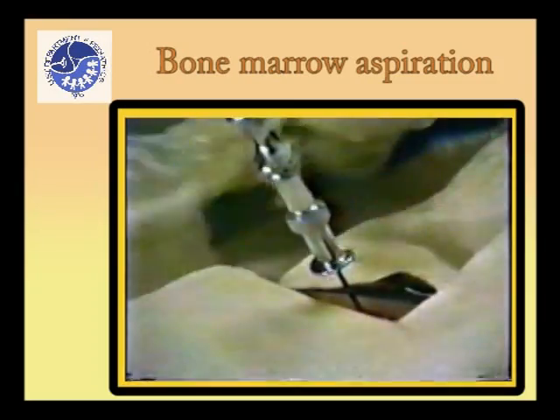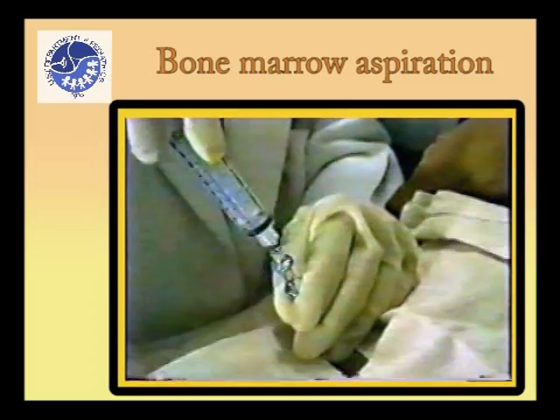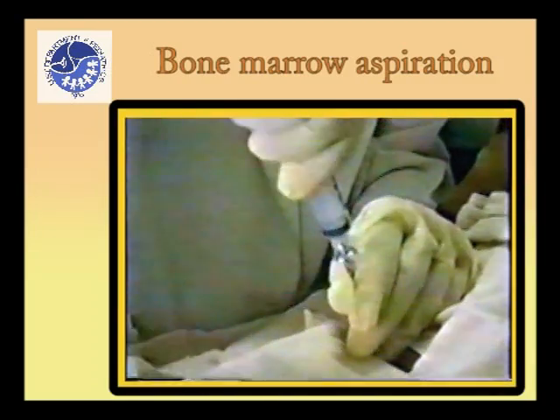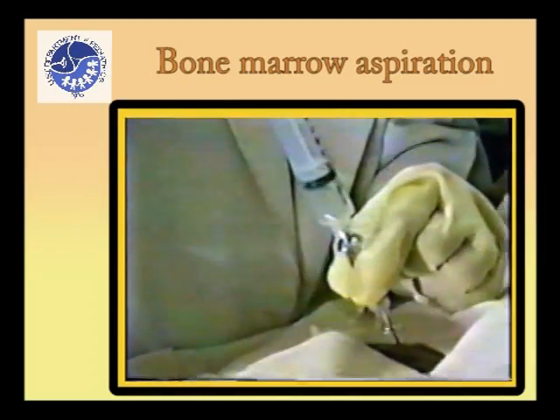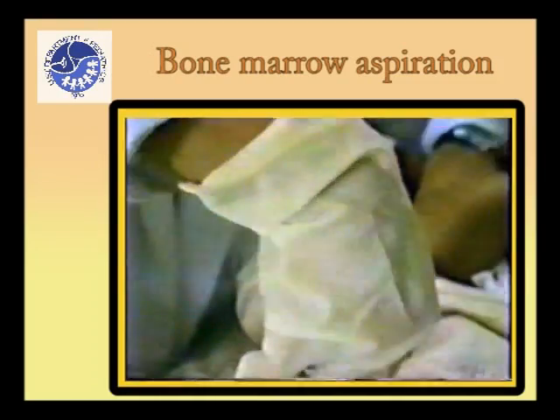At this stage, remove the stylet from the needle and attach a 10 milliliter syringe to the needle. Apply suction by withdrawing the plunger of the syringe until the first drop of blood appears in the syringe, at which point remove the needle.